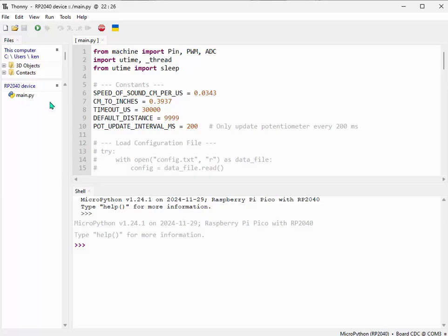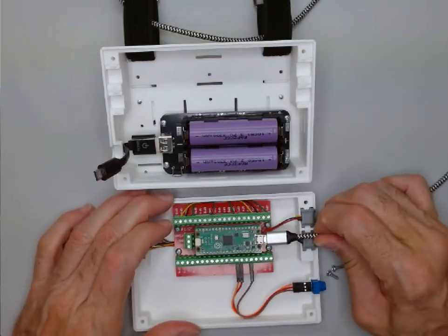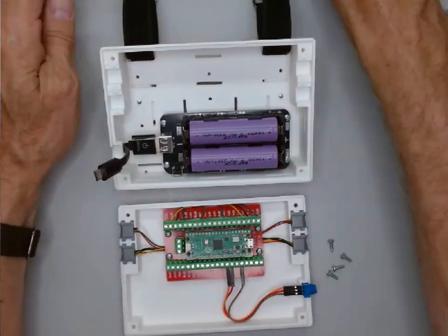So here it is on the device, and really we're done with the transfer of the software to the Pico. And we can shut Thonny down. Now we're back at the device. I can remove the USB cable.